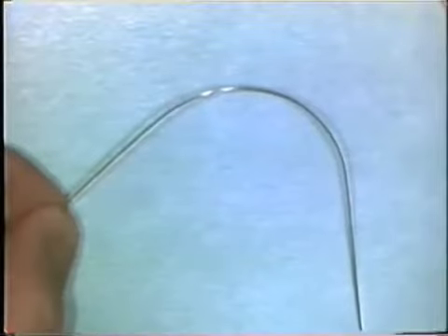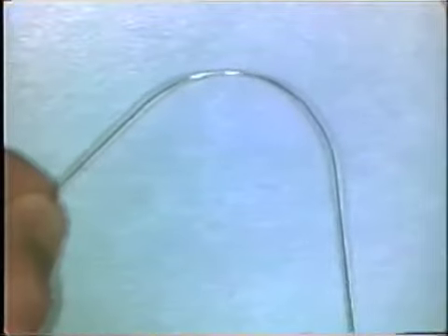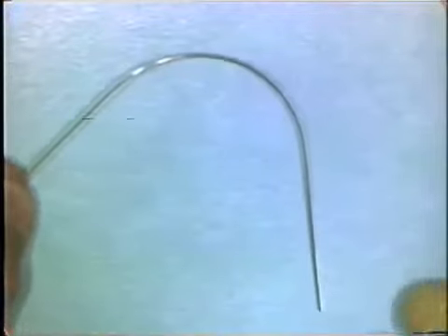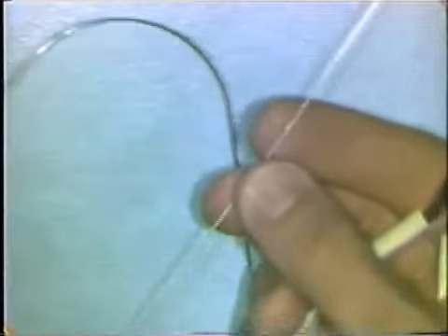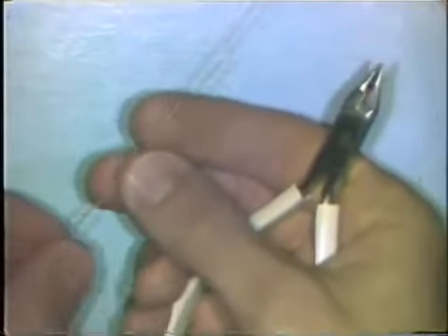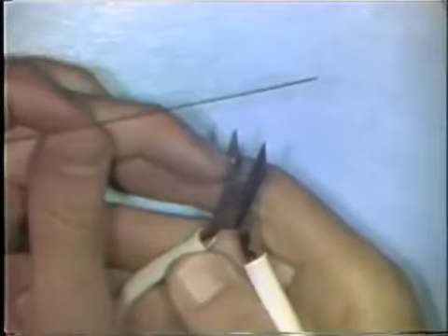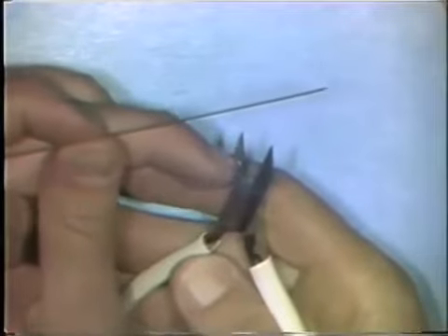Curves are formed from a series of small bends that are very, very close together along a wire. To make a curve, you use the 139 bird beak pliers and you place the wire deep into the plier beaks near the larger portion of the round beak of the plier.